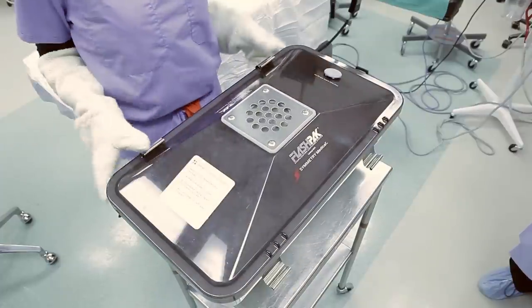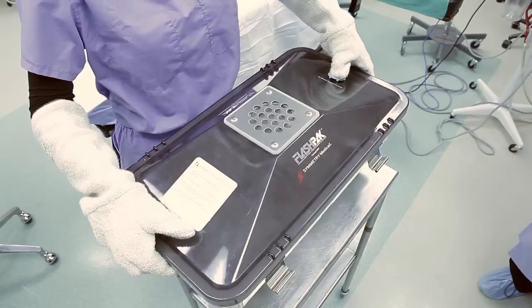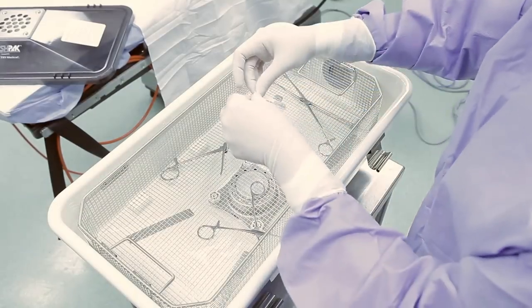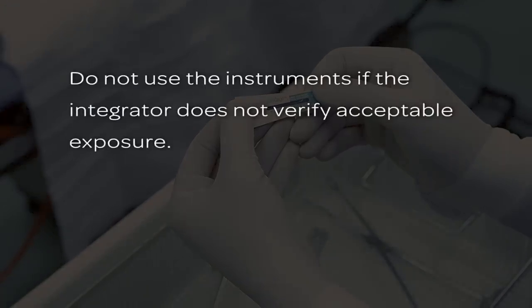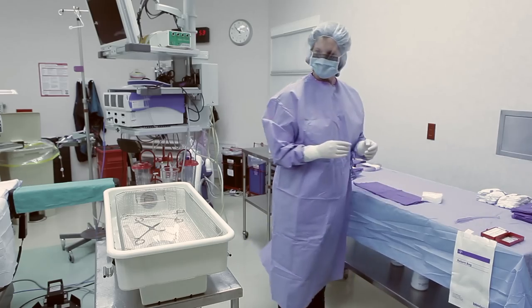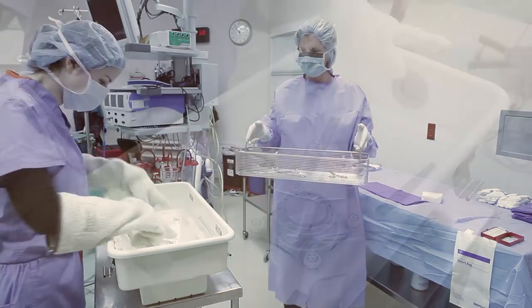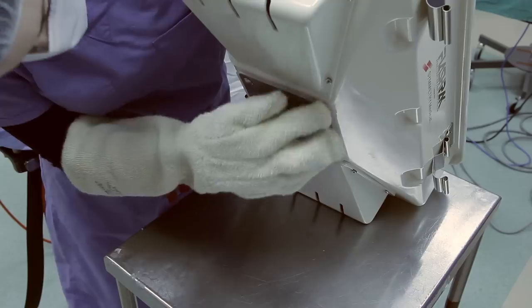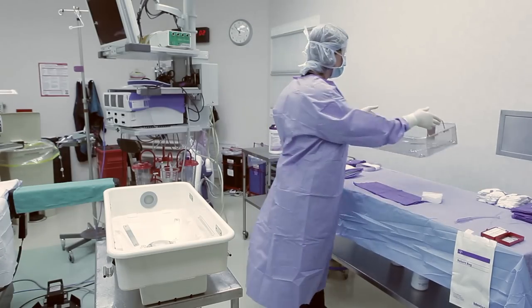Unlatch the lid on all sides. Press the pressure relief button and remove the lid. Verify that the multi-parameter chemical integrator indicates acceptable exposure. Do not use the instruments if the integrator does not verify acceptable exposure. Aseptically remove the basket and contents according to the established best practices of your healthcare facility. Visually verify that the base valve plate fully engages the silicone valve gasket around its entire circumference before the basket or its contents are placed on the sterile field.